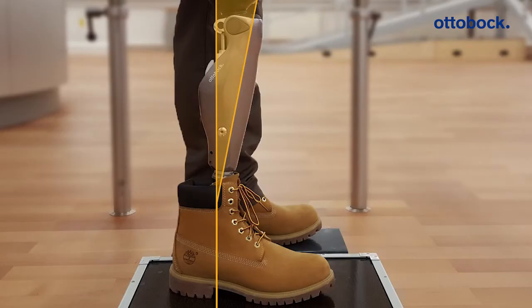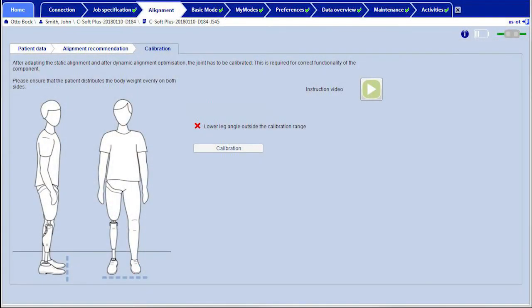If the lower leg is tilted too far to the front or rear, you will receive a message that the lower leg angle is outside the calibration range. Check whether the user is in his or her natural upright position. The less than optimal prosthetic alignment may be the cause in this case as well.